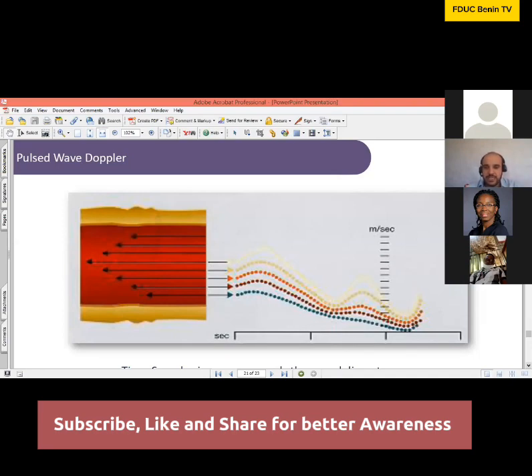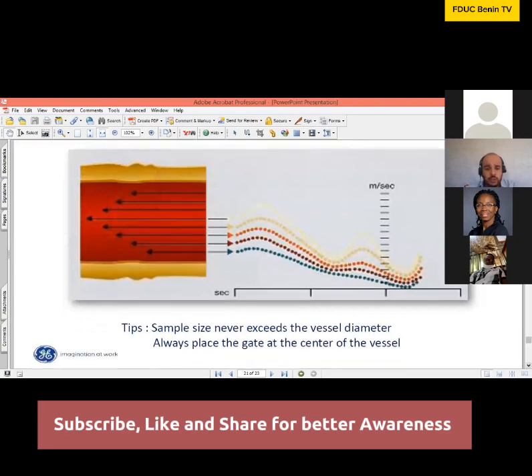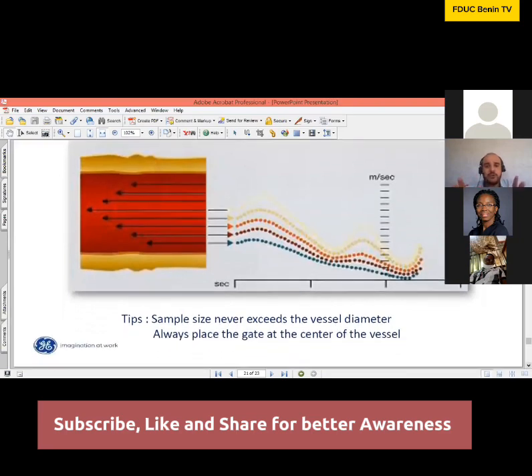I don't have the same speed. So that's why the tip here is that the sample size should never exceed the vessel diameter. Of course, this is very important, which is normal. I'm sure we're all doing that. And then the second thing is that we should always place the gate at the center of the vessel.